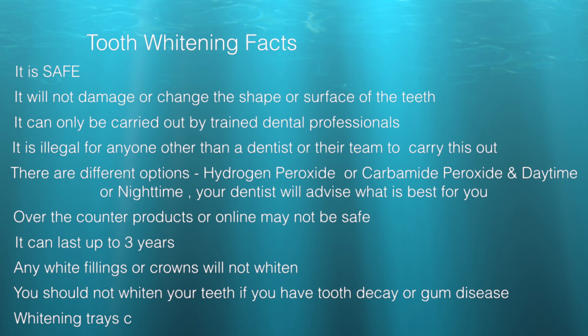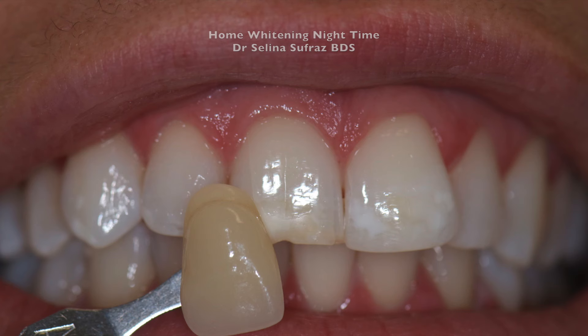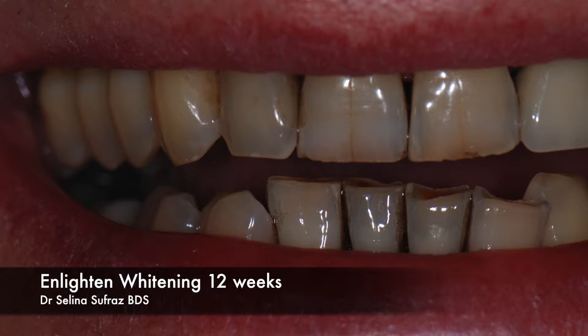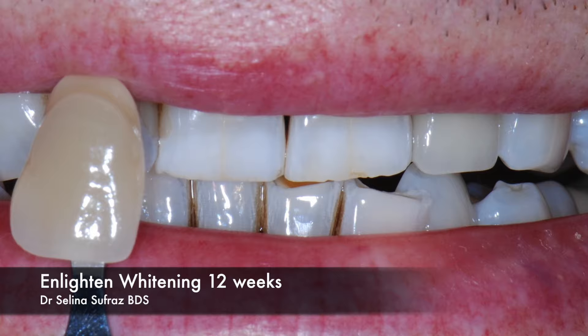These are teeth that have been whitened with home whitening — 16% carbamide peroxide for 14 days overnight, every night. Lovely result. These are also 16% carbamide peroxide for two weeks at home, but note the little white spots that have become more apparent on this whitening. This next person whitened for 12 weeks — that's three months. He had very severe staining and tobacco staining, and after 12 weeks of whitening using the Enlighten product, his teeth are looking much better. He was very happy.